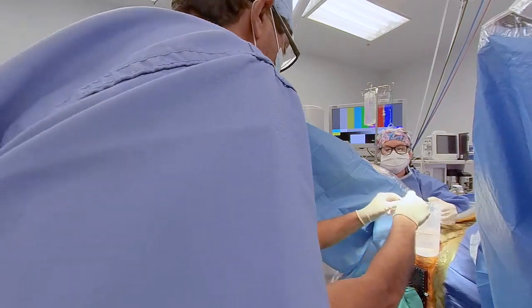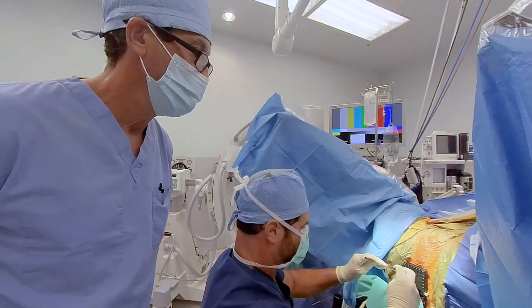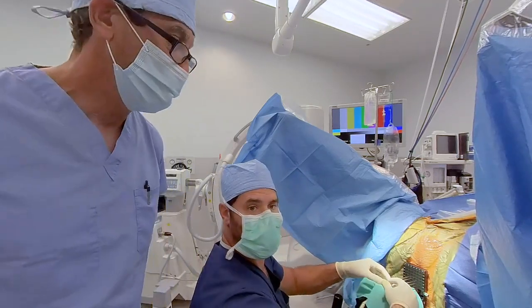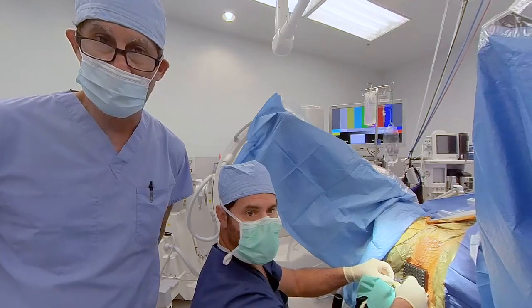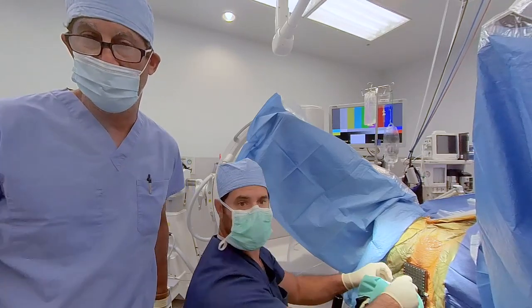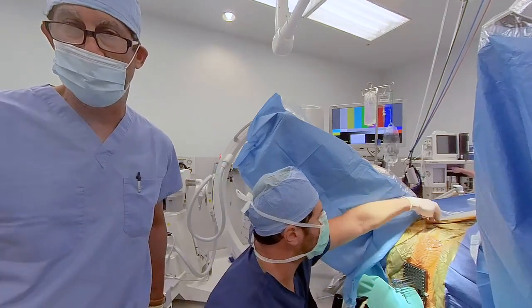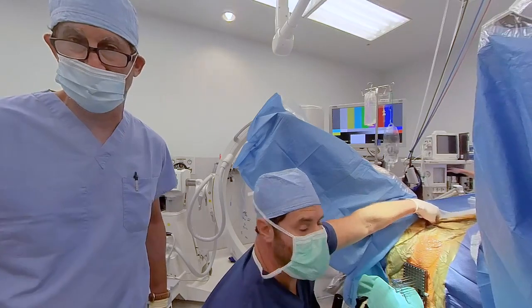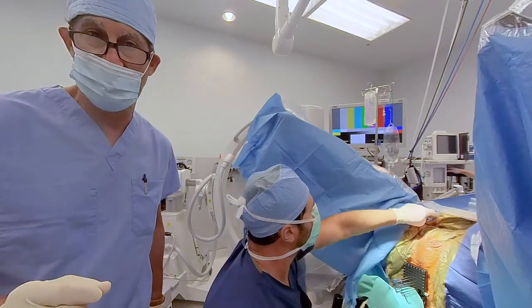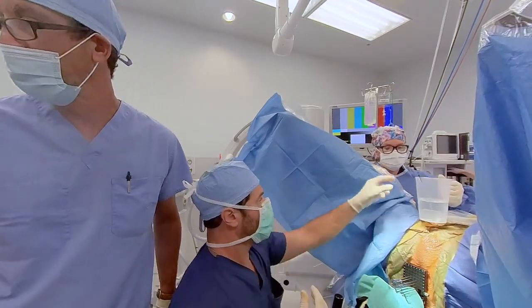Dr. Raven, can you just tell us about what you and Dr. Terranova's general implantation needle pattern is? Yeah, so generally Dr. Terranova places a majority of the needles around the periphery of the gland, walking at anywhere from 1 centimeter to 5 millimeter intervals. And essentially that's the majority of the needles. And then we look to place central needles in a box-shaped formation around the urethra, at least 1 centimeter away. So the primary pattern is primarily a peripheral loading.